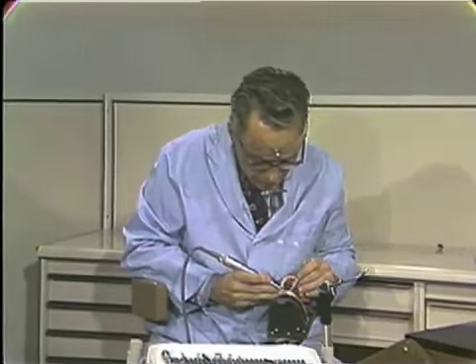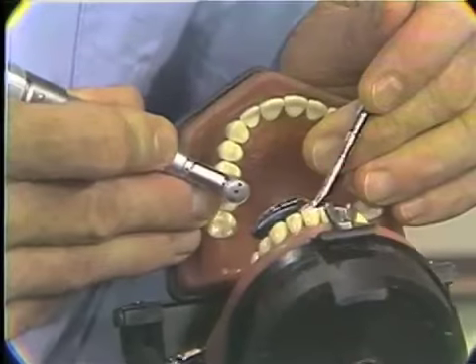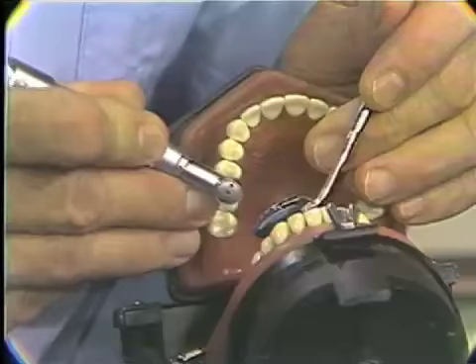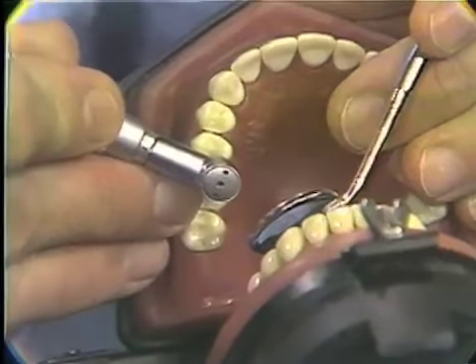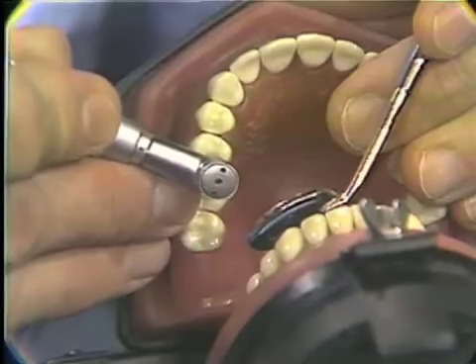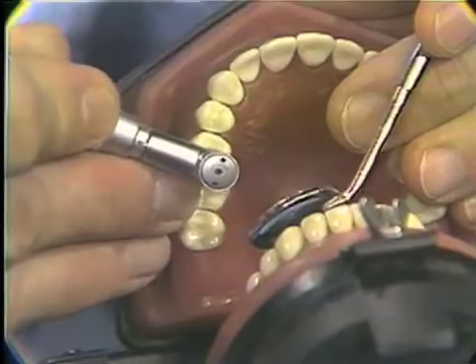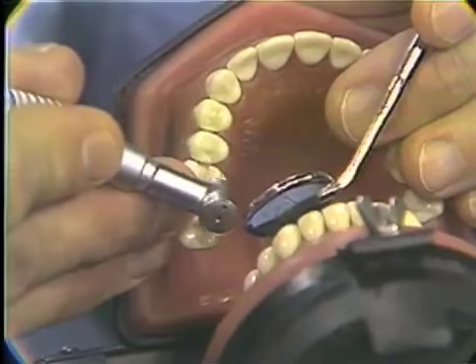This is a sweeping motion, as you can see here. I'm going to draw this across, not put it into a tilting situation, or you will undercut the cervical points. Now, starting the engine, we will just sweep it across like that. That will probably place the bevel on the cervical.